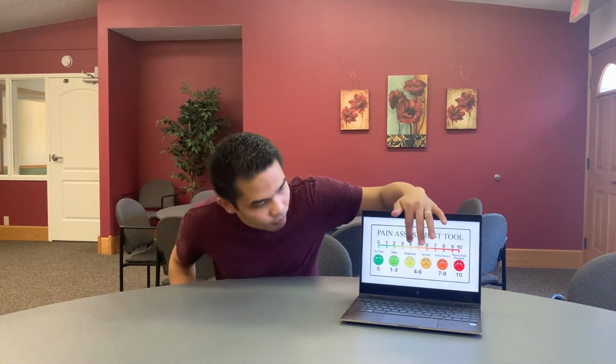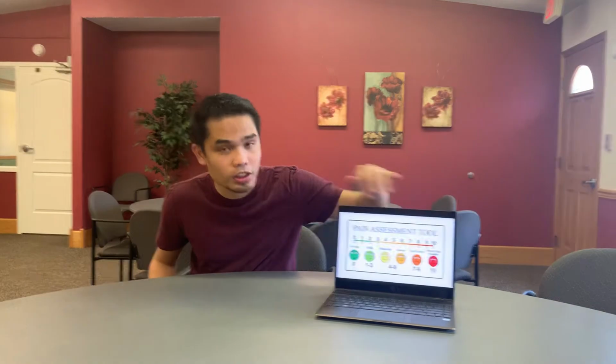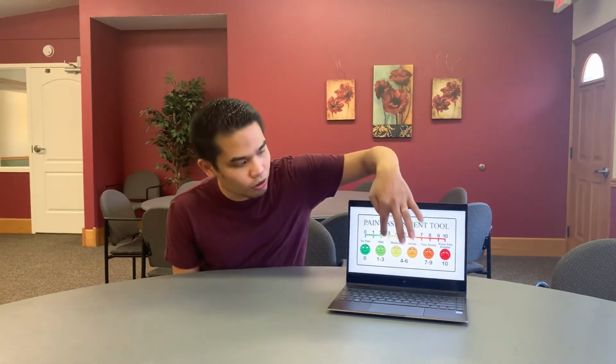When they come inside the PFT room, we always obtain their height and weight, and also take note of their pre-assessment vital signs, such as the BP, the heart rate, the respirations, and their SpO2. Before we start, we also ask the patient for a pain assessment, using the pain score with the facial expressions or the number itself.